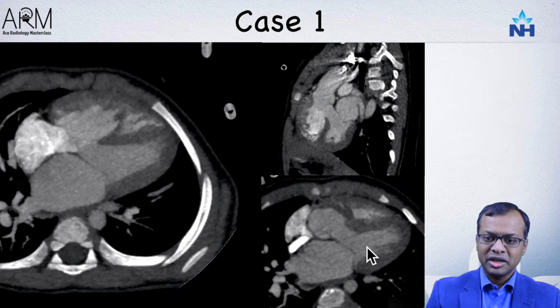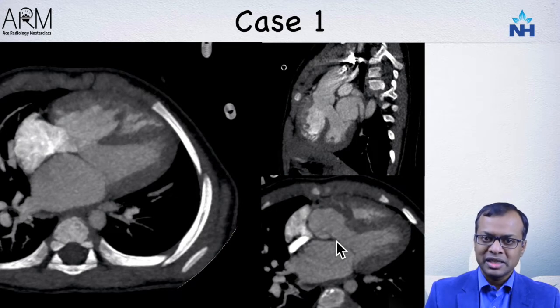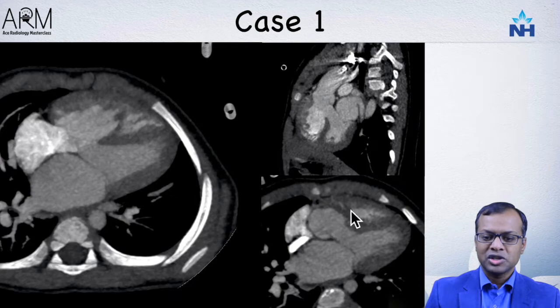In another image you can see the LV connecting to the aorta, and the mitral valve and aortic valve have a common insertion point — termed aortomitral continuity. When you see this, you are not worried about DORV (double outlet right ventricle). If the aorta and mitral valve do not have this continuity, then the aorta is most likely arising fully from the right ventricle.